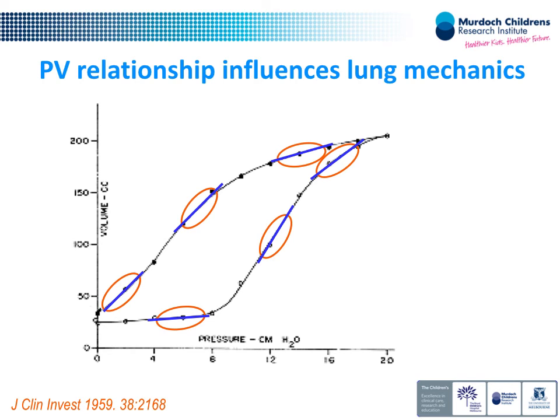But that's different. I can tell you in a lamb, I can do this on conventional and get the same outcome. And hopefully this afternoon in the pigs, we will have time to do this on conventional and do the same thing. The mode of ventilation doesn't matter. You can recruit the lung. The risk in conventional is that you're going to take the lung through bigger tidal changes, and you will take the lung up into overdistension much quicker than on the oscillator.